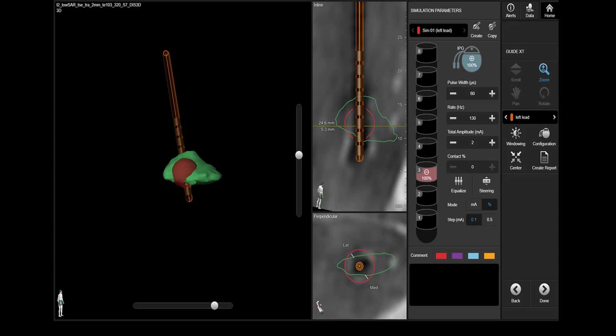The final step is of course a visual model with the exact location of the electrode and of the relevant anatomy based directly on the individual patient, as we see here. Thus, visual programming is nothing new, but the recent advances in technology have taken it to a completely new level. Now we do not have to be satisfied with our mental image.